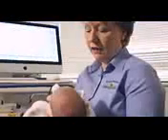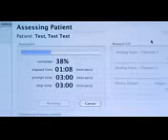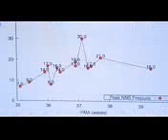the pacifier down to fractions of a centimeter of H2O, extracting extremely detailed information about what that patient's doing, whether they're using their tongue, whether they're compressing with their mouth, how those compressions are grouped. All of this information goes into an overall understanding of how the patient's suck central pattern generator is functioning, how effective, how coordinated they are with non-nutritive sucking.